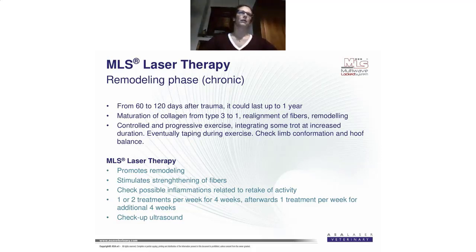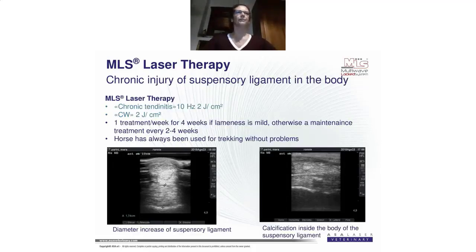So in this phase, normally I treat 1 or 2 treatments a week, normally 1. And then I continue with my checkup with the ultrasound, just in order to know what is going on and to choose the best protocols, the best frequency for the case.